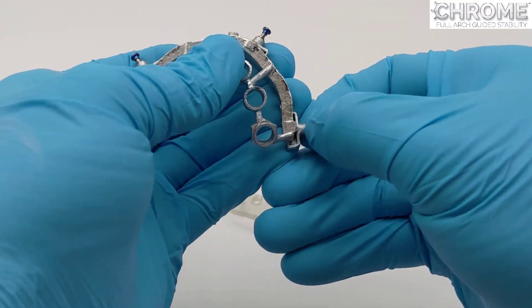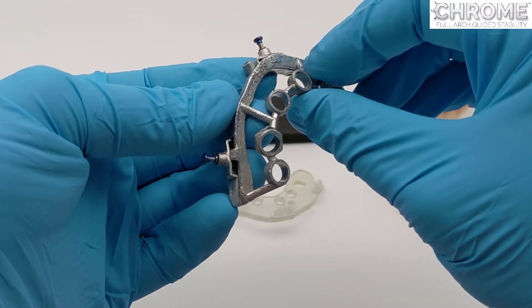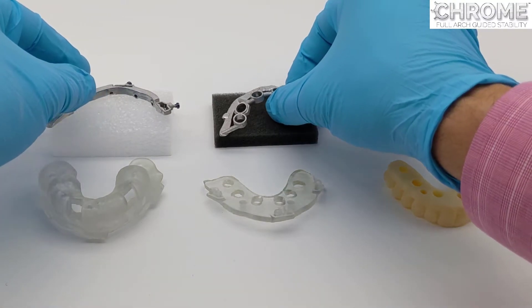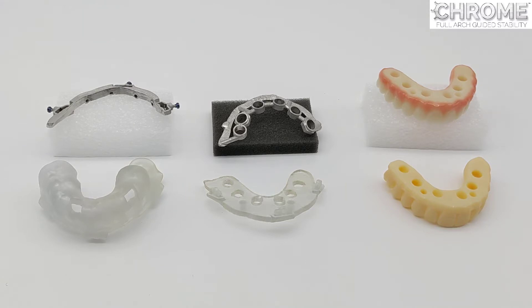The osteotomy guide is also connected to the fixation base via the chrome locks, and they are designed for both fully guided and partially guided systems.